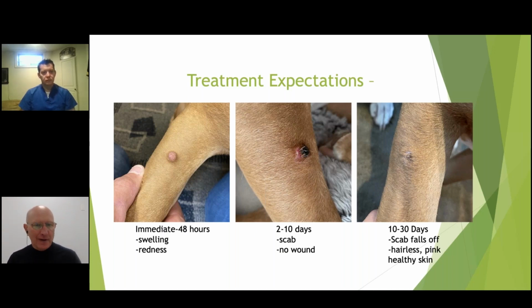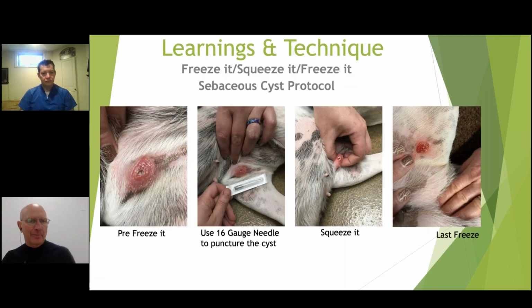If you don't see the redness and you don't see that little bit of swelling, then you likely did not do that initial treatment correctly, which means you froze for too short, or if you were using a spray, you were too far away. And this is the one training issue that we've had to work through with people. So we put it in the slide deck. It's now immortalized in the lecture, but we give you that as that one tidbit we want you to take away. Now, in the next slide, we want to talk about some learnings in the past year and little technique hints that have come up.